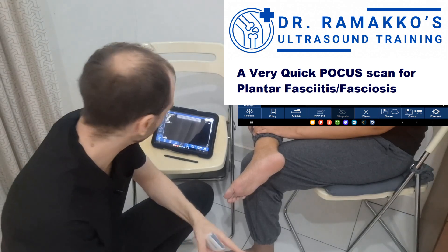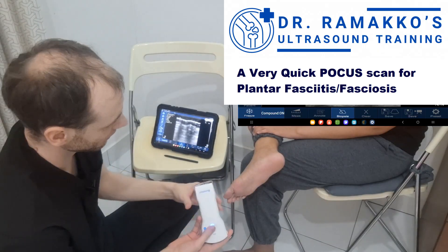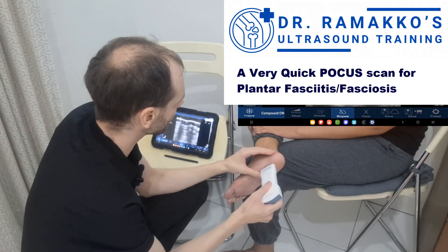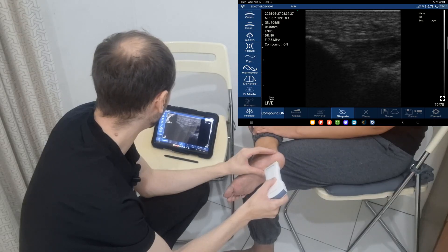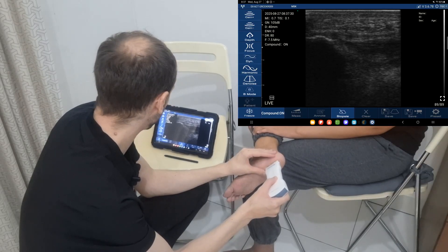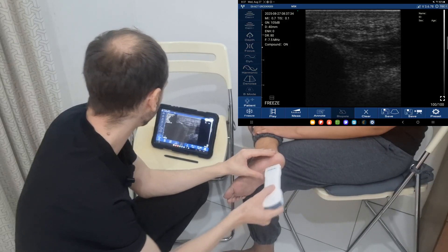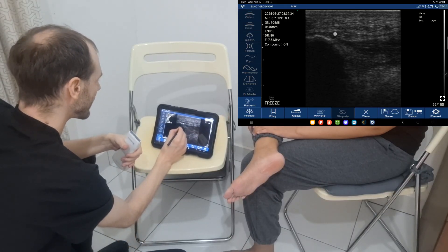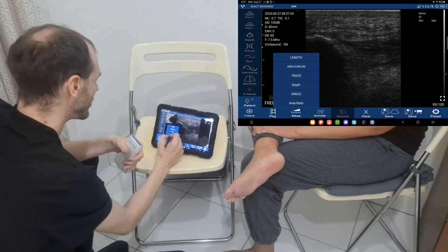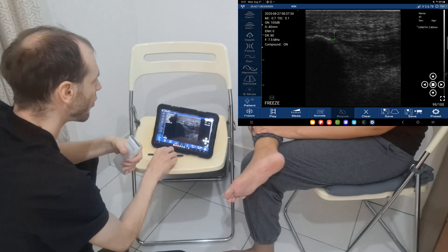We'll get some gel on here, turn it on, and let's go. So we're seeing the calcaneus as the cortex there, and there's the plantar fascia — it wasn't so bad, actually pretty easy. Here's the surface and here's the bottom of it, and that's the thickness we need to measure. Grabbing the measurement tool, we need a length — and it's 2.8 millimeters.